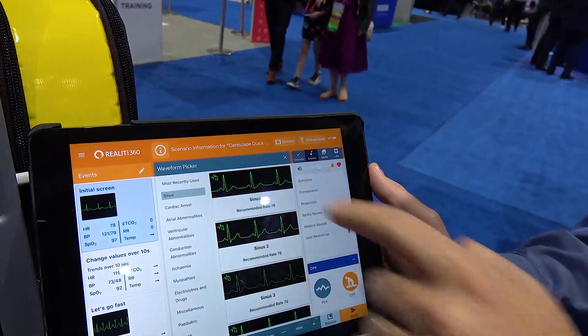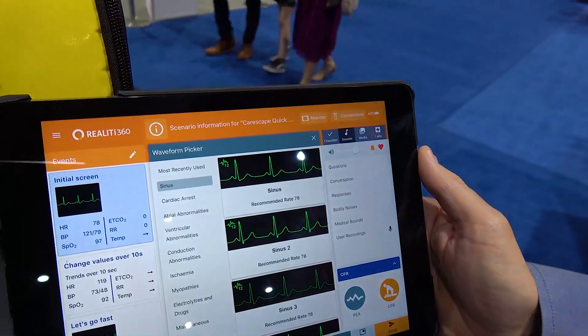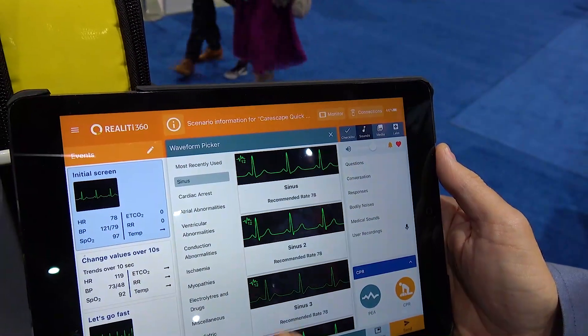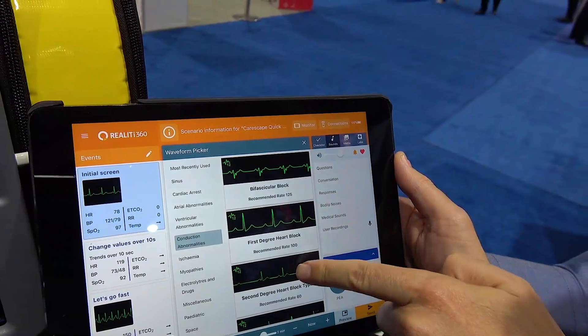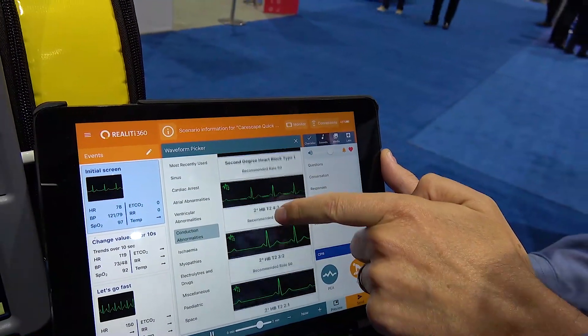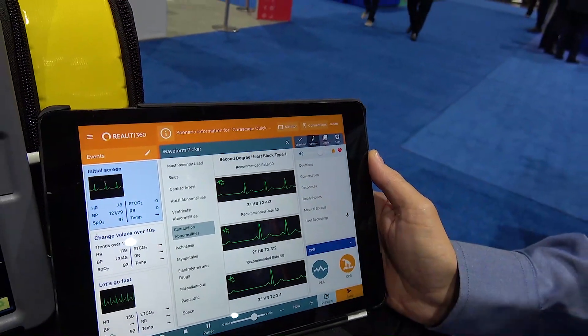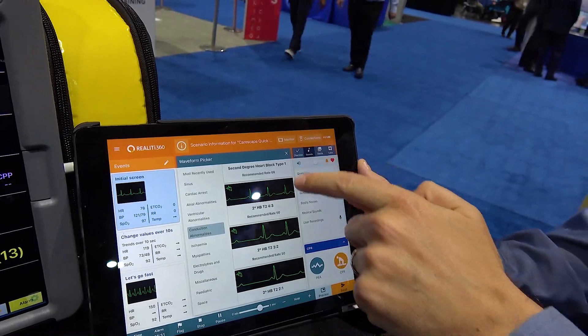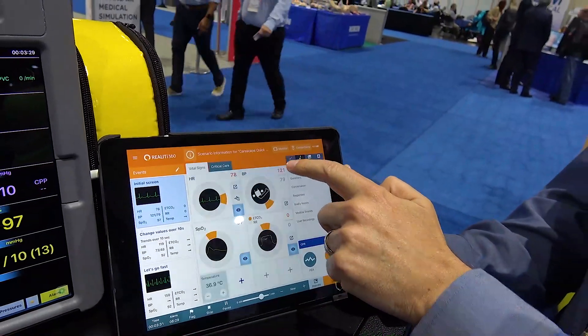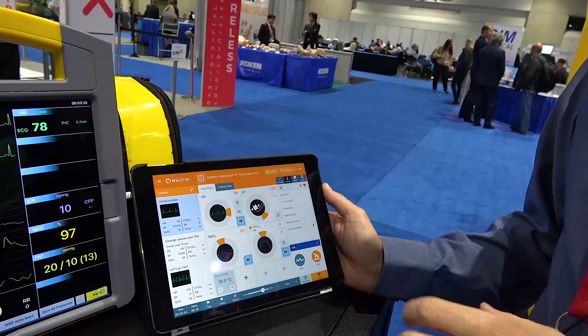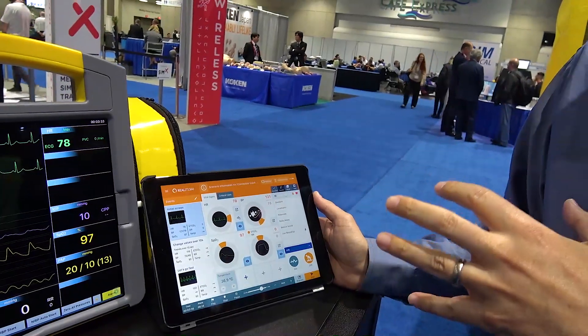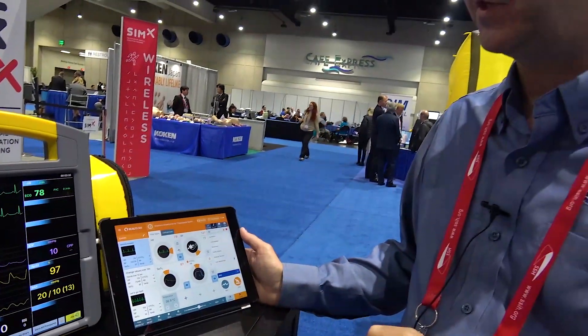You'll see this little icon showing '12', so we've really gone through a lot of the waveforms and added 12 leads to pretty much all of them. We now truly have a complete, realistic 12-lead system that is correctly controlled throughout all of the different ECG leads.